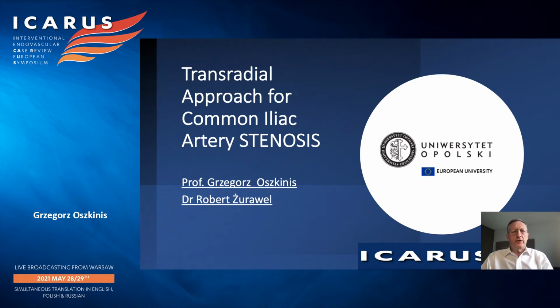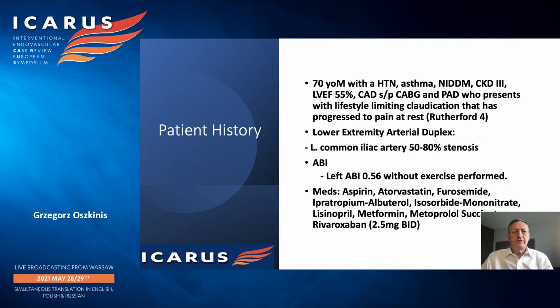We want to show our case with transradial approach for the common iliac artery stenosis. It was a 70-year-old man with hypertension, asthma, diabetes, coronary artery disease after the CABG operation, and peripheral arterial disease who presents with lifestyle limiting claudication that has progressed to pain at rest.